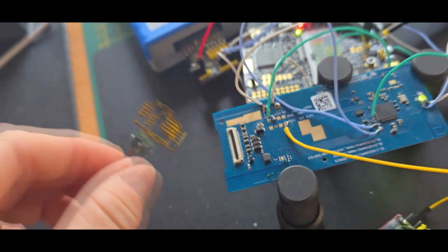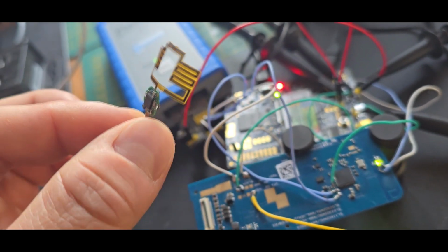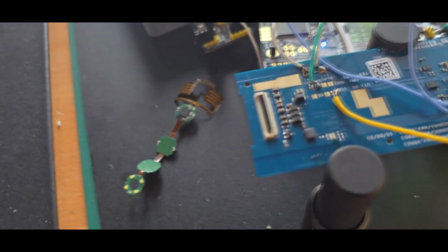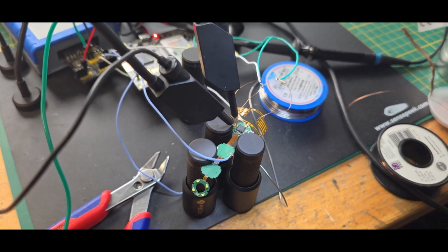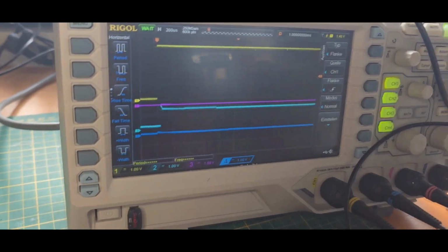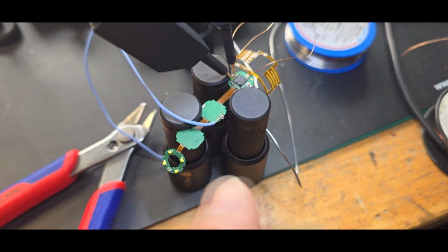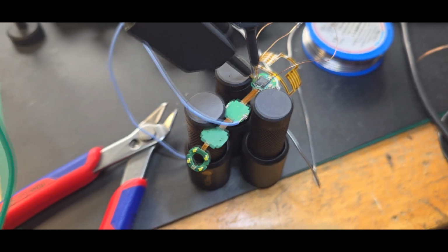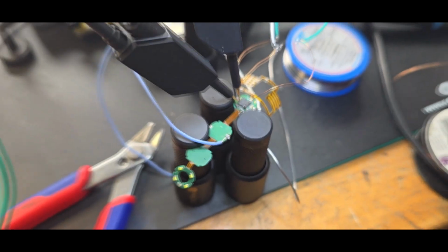So we have here basically the boot sequence, and if we glitch roundabout here, it sometimes has access to JTAG. The next step is now to replace the PCB with each other and dump out the full flash from the pill camera. Well, this did work better than expected. After just around 4 to 5 minutes of glitching, the real PCB was successfully glitched and we got a perfectly fine dump of the flash, which can now be reverse engineered to find out how the CC1310 talks to the receiving side, the monitor, and maybe get some pictures out of this camera.